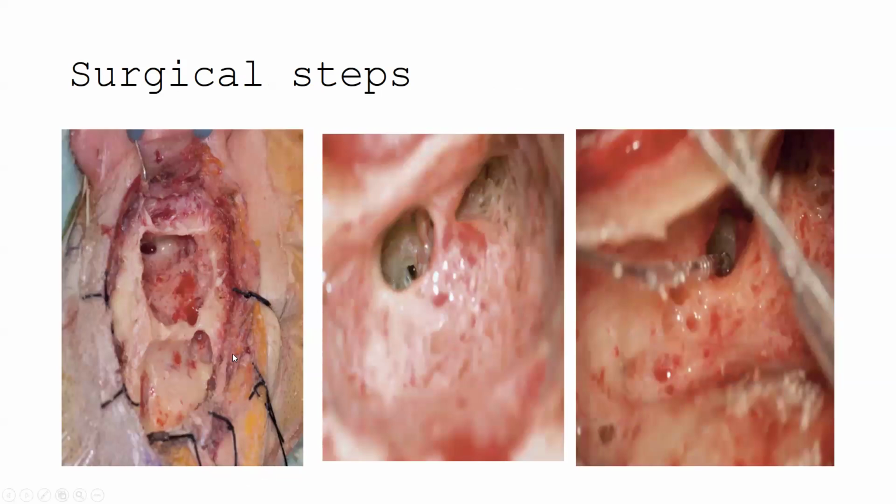And then we'll drill a well for the device. This is also manufacturer dependent. Usually they will provide a template to help us size the pocket very well. And then the best position to open the round window membrane is anterior.